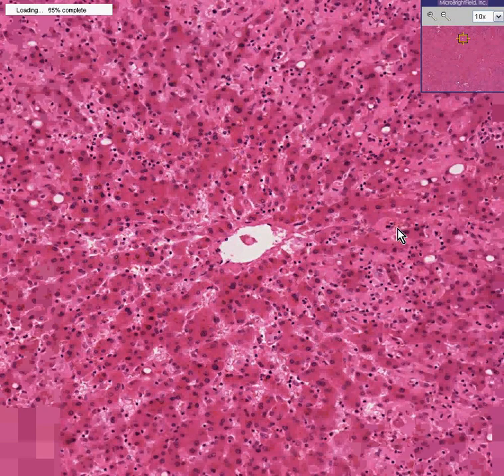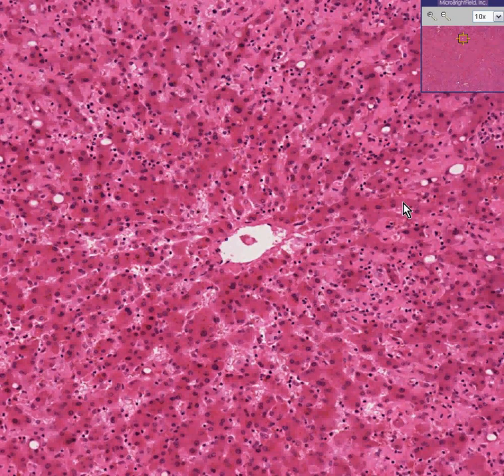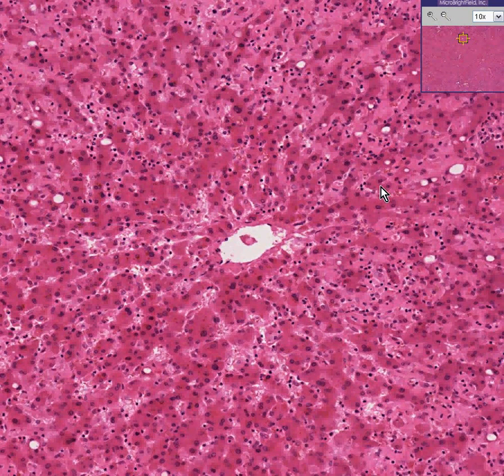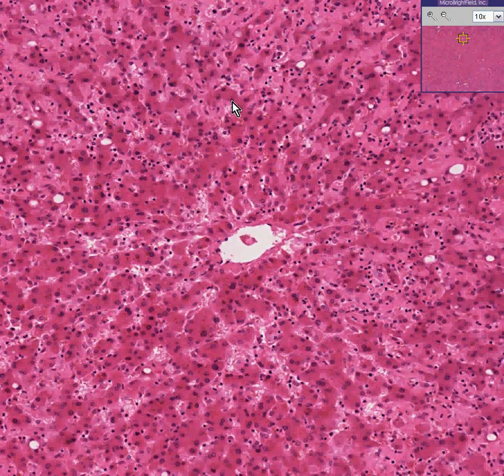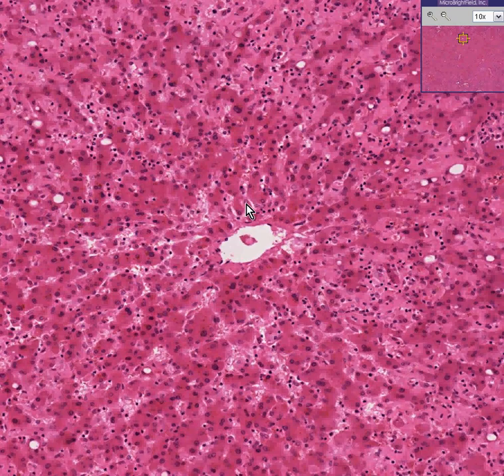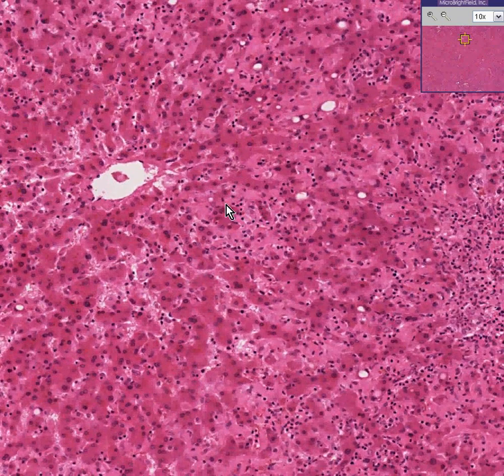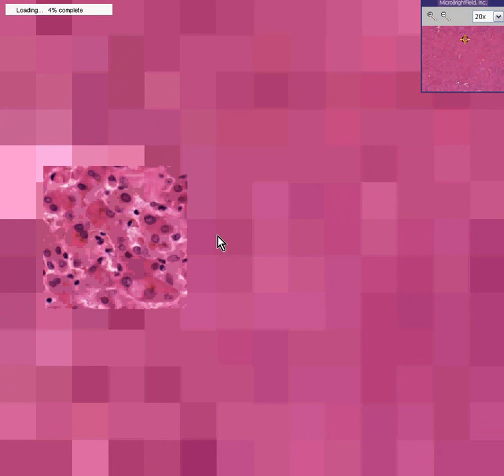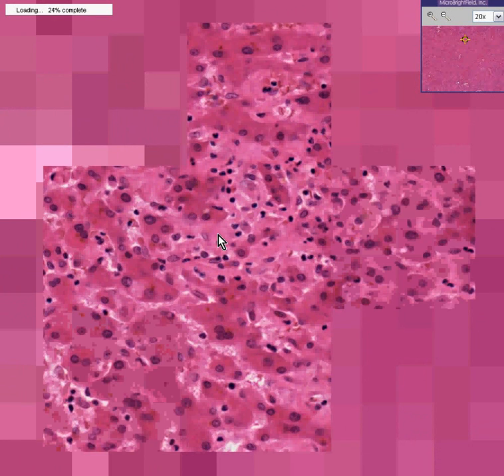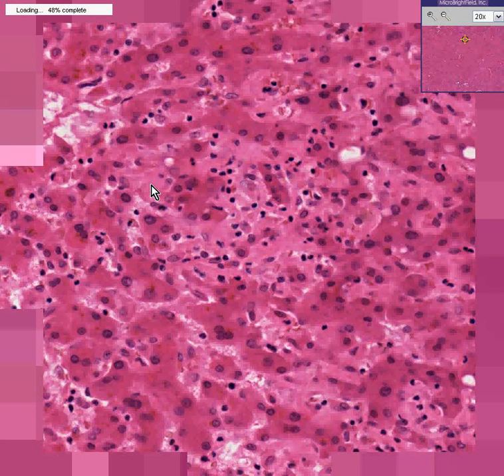You can see the normal hepatic cords here, and theoretically the spaces between them are the sinusoids. But the sinusoids are filled with this pink, eosinophilic, glassy, or perhaps finely granular material.